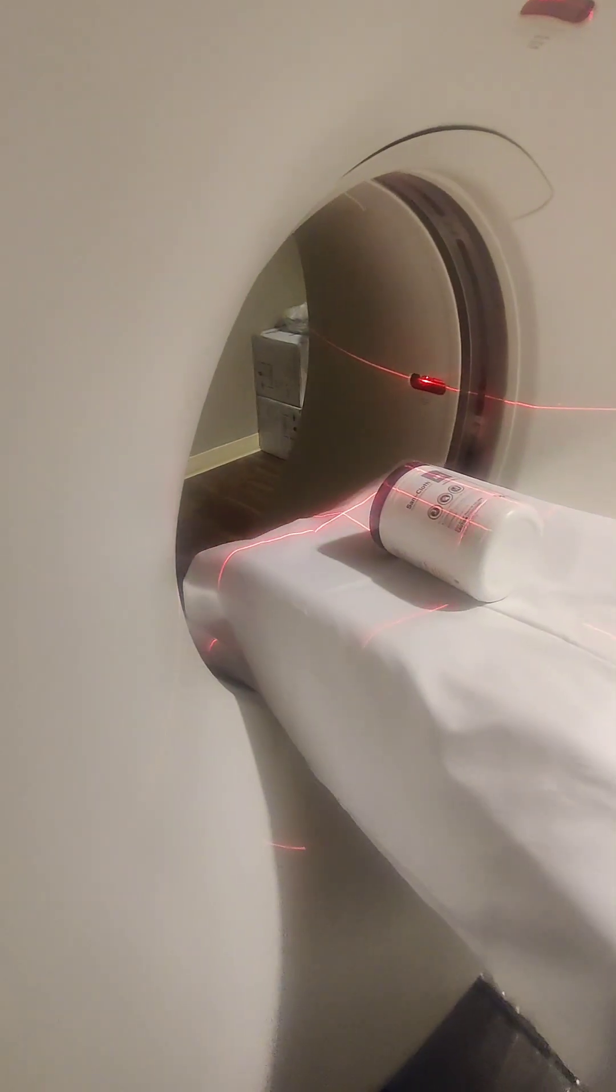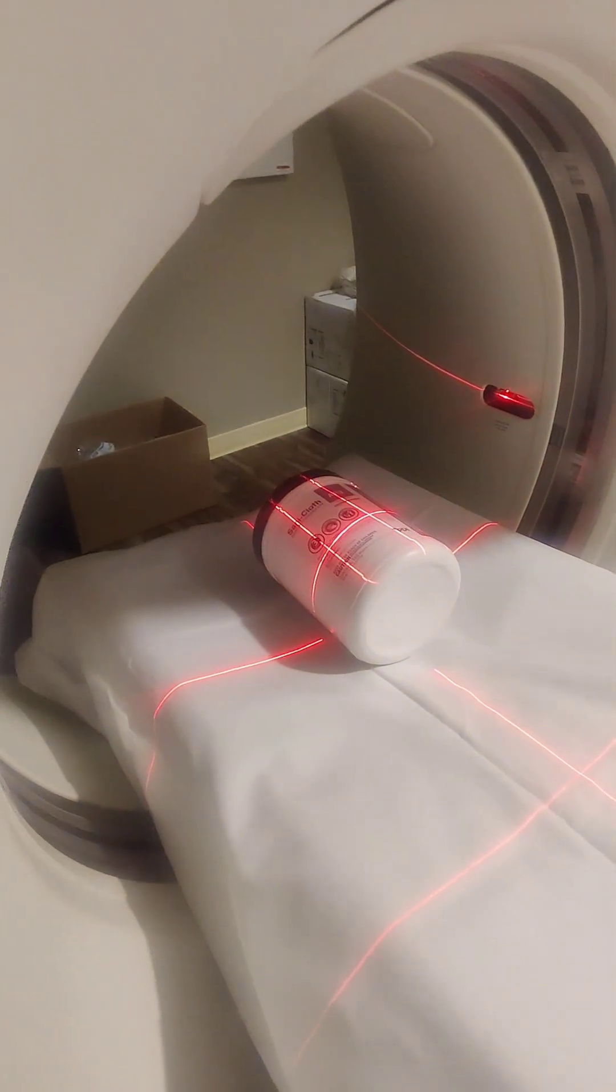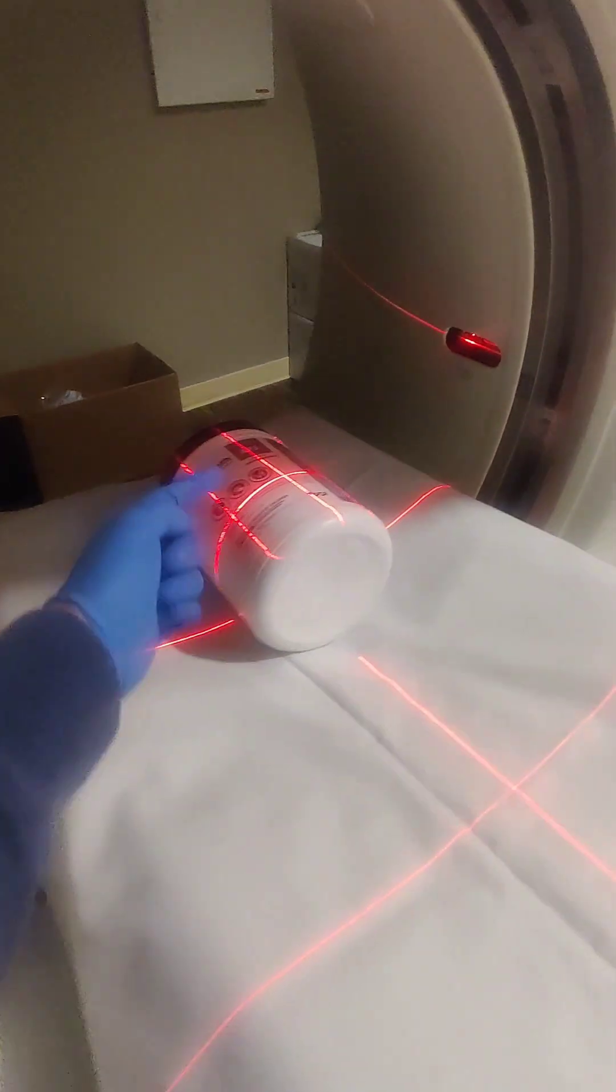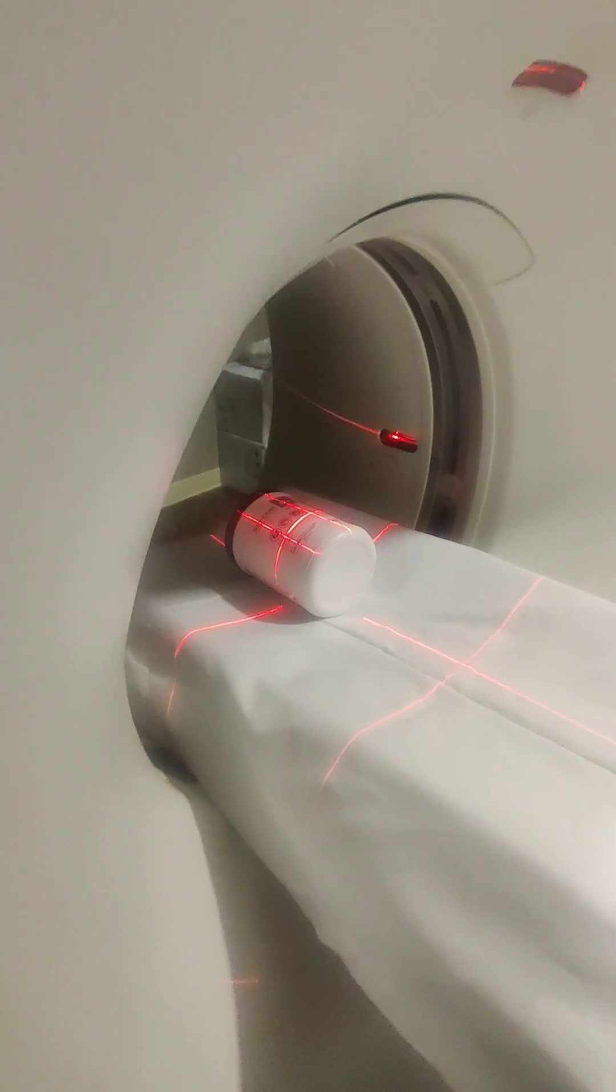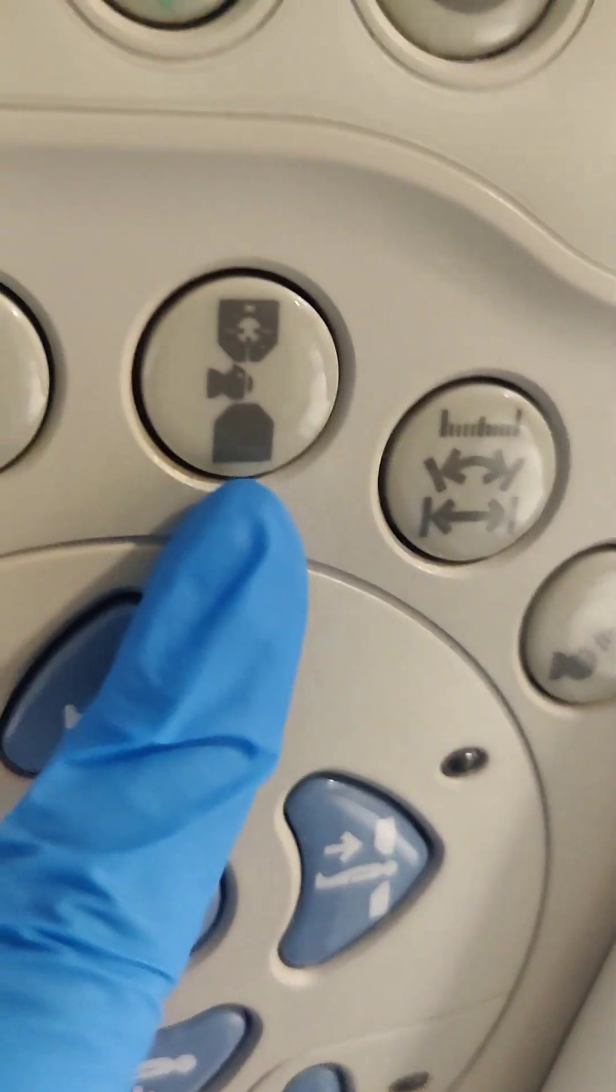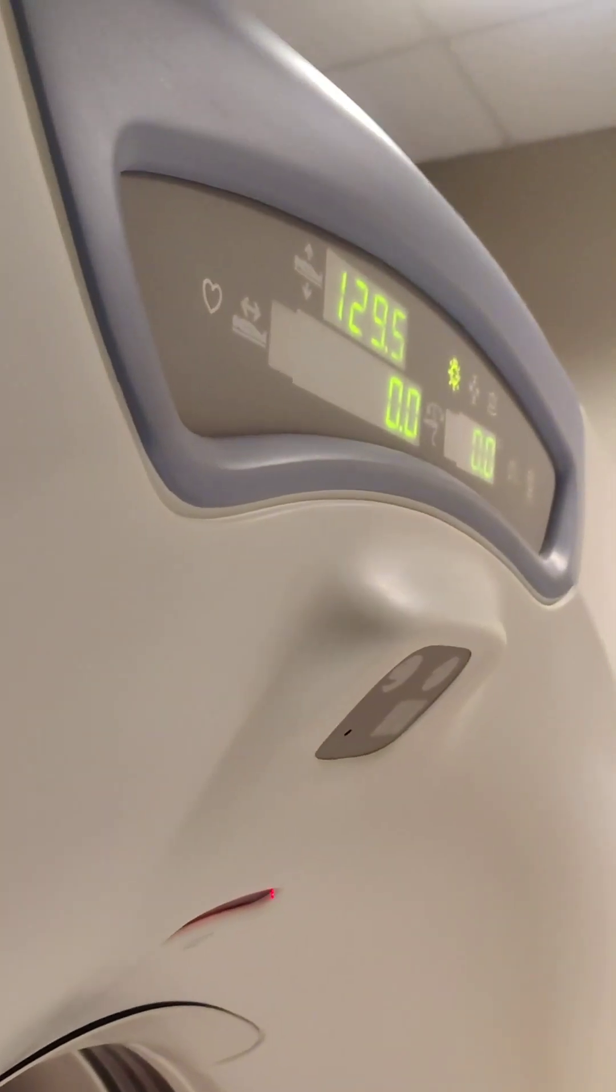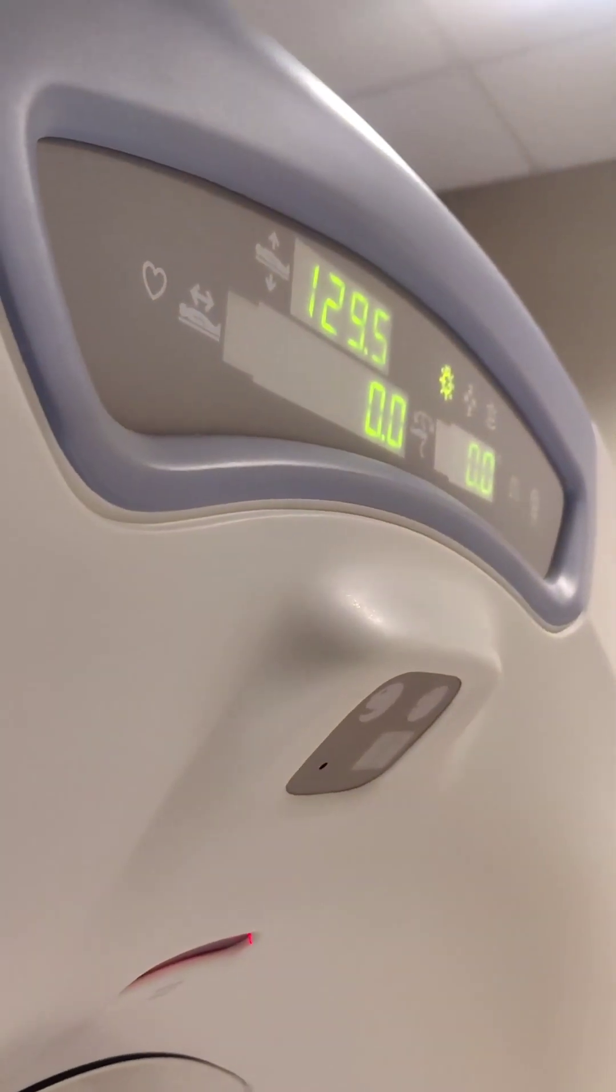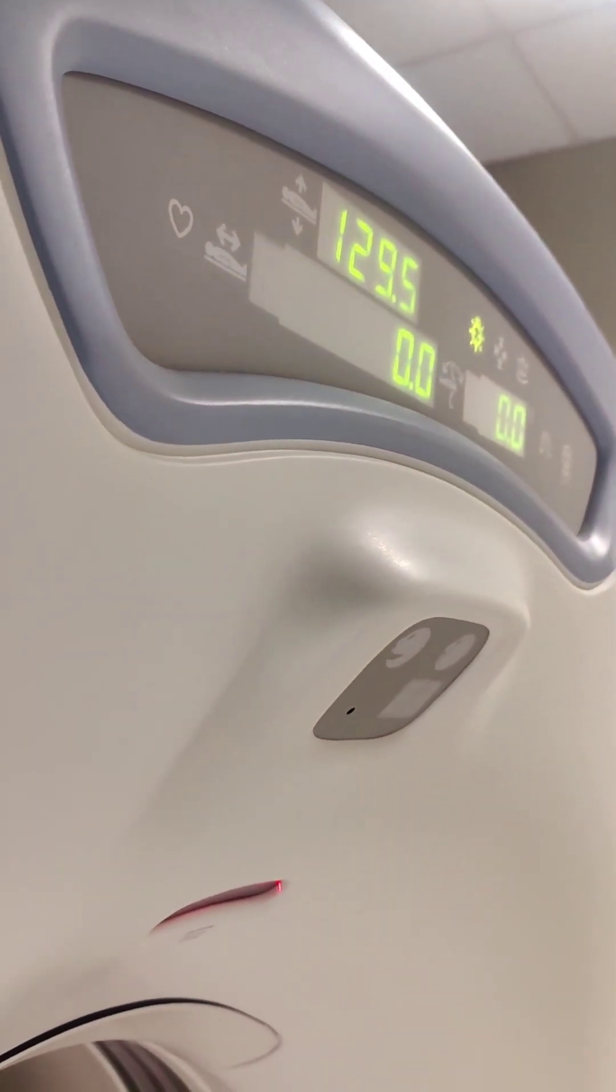But if you set it inside, let's go inside. You can use your foot pedal too. You set it to your inside, so under the eye to the meatal. And you click the inside light. See, it changes to zero. That's outside, inside.